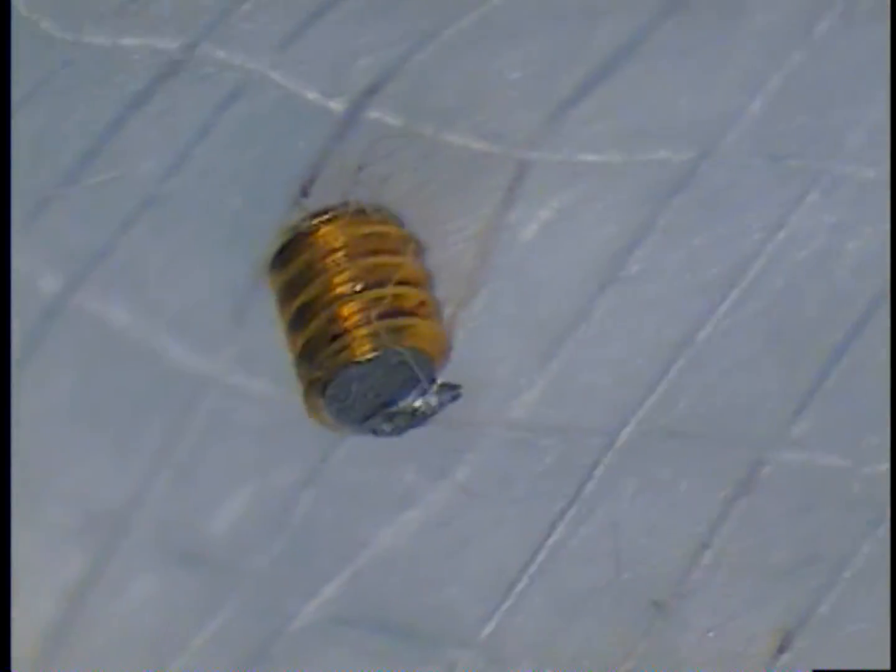Just remember: do not go in there with any forceful instruments — not even a round burr or anything that is sharp on the end, or even a blunt end. You have to pre-soak first. That is the key: pre-soak your cases with tartar and stain. Look at the size of that. You can see that I am trying to examine to see if any of the gold flakes have come off, but it seems like it is still intact.